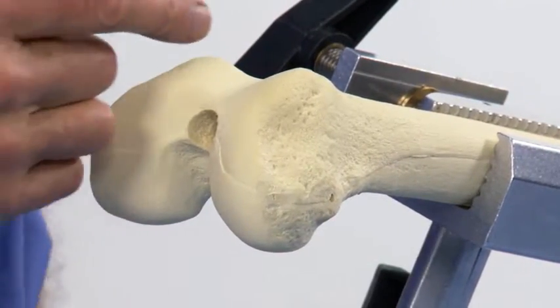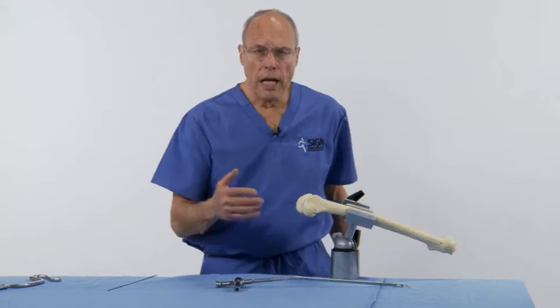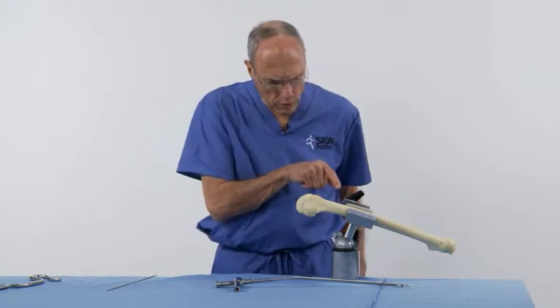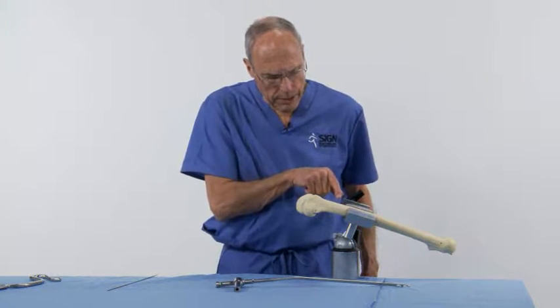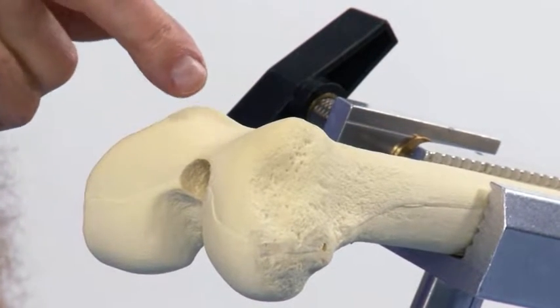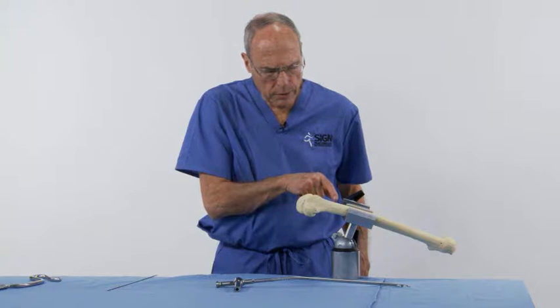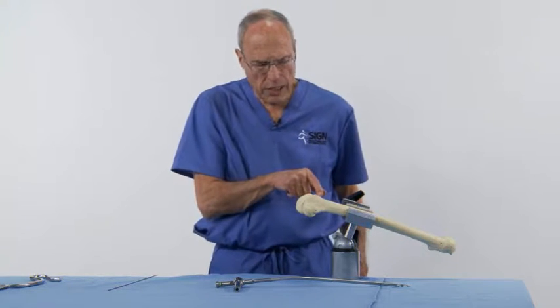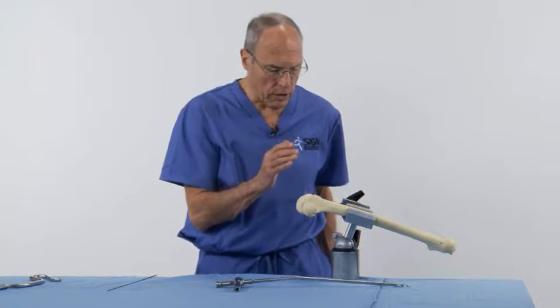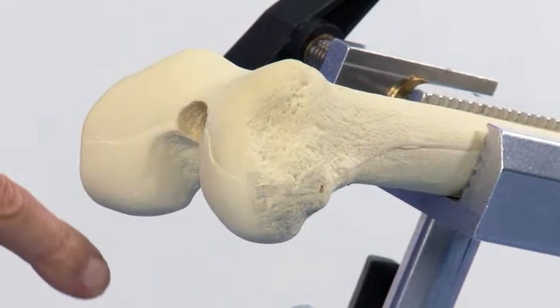If there's an intercondylar fracture, a fracture going into the joint, I use the total knee implant incision. This is a straight incision beginning by incising the quadriceps tendon, going over the patella down to the tibial tubercle. Patella tendon is then incised from the patella only about 1/2 and certainly no more, and a medial parapatella incision is used.